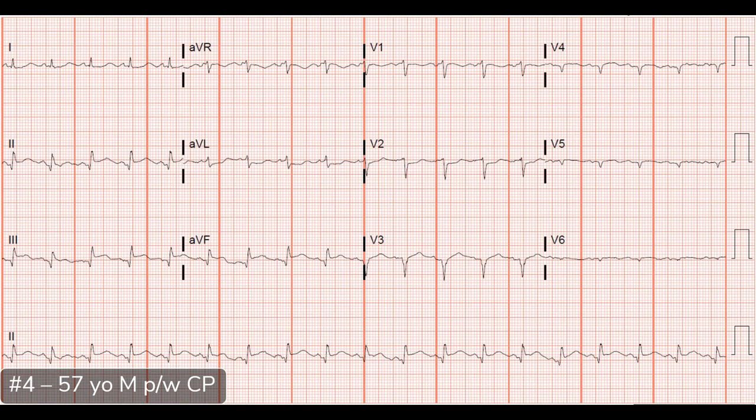Looking at this ECG, the rate is just about 100. The rhythm appears to be sinus — there's a P for every QRS and a QRS after every P. The P wave morphology looks similar and the P wave axis is appropriate. The overall QRS axis is normal with normal intervals. When it comes to ischemia, I do start to see some signs — ST elevations in the inferior leads 2, 3, and AVF.